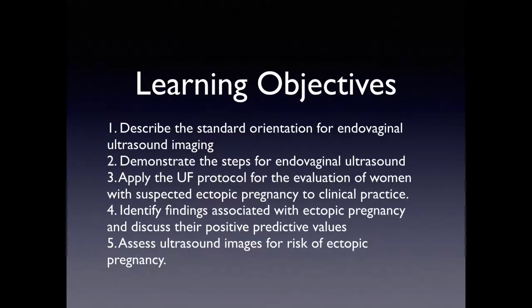We're going to describe standard orientation for endovaginal ultrasound, demonstrate the steps for endovaginal ultrasound, apply the University of Florida protocol for the evaluation of women with suspected ectopic pregnancy to clinical practice. We're going to identify findings associated with ectopic pregnancy and discuss their positive predictive values, and also be able to assess ultrasound images for risk of ectopic pregnancy.